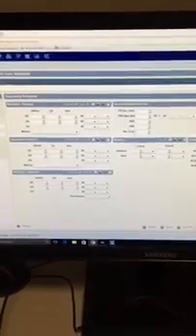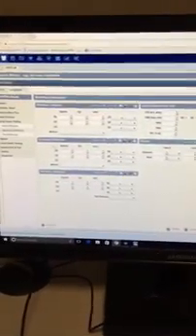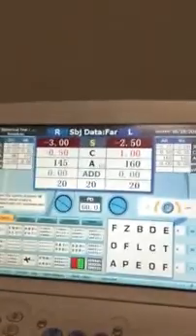And then I'm just going to go to the secondary refraction portion. This portion I barely use, but if you have any supplemental information, for example, NRA, PRA, cycloplegic refraction, phorias, or divergences, I input that there. And if you go to the final refraction, this will also be populated by the Topcon autophoropter. Basically, what information you have here in those big squares should populate into this area. So I'm going to show you how to do it.